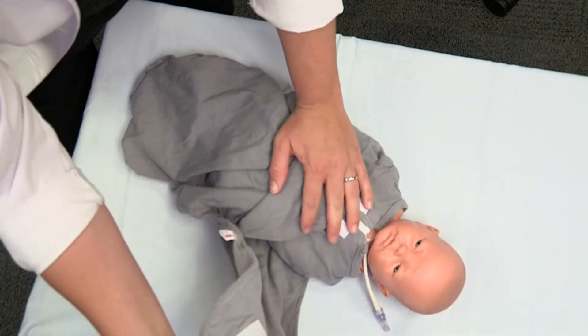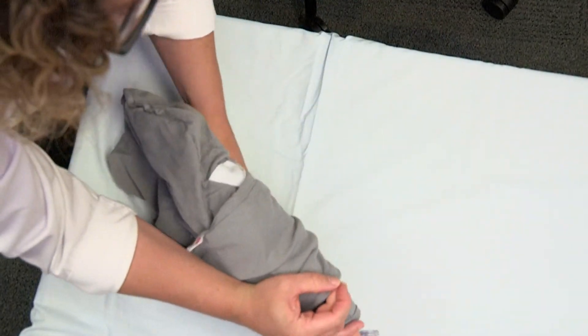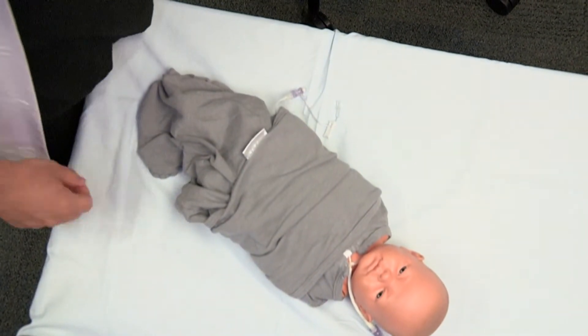Close the straight wing of the swaddle, ensuring that the wing is 2 inches below the baby's shoulders. This will prevent the swaddle from riding up. Lastly, check the fit of the M-Bay Swaddle and verify that it is not covering the hips.